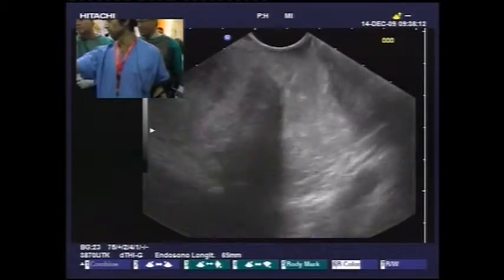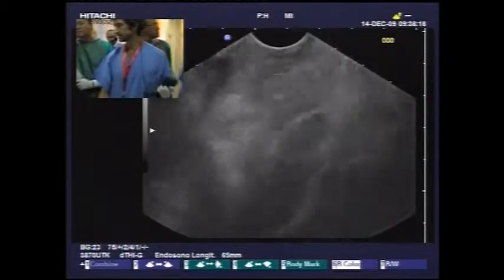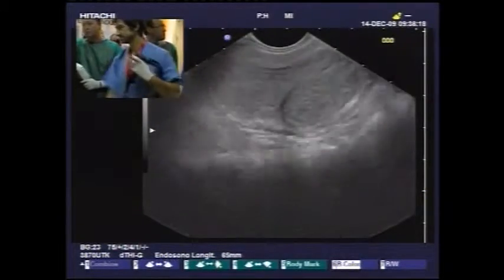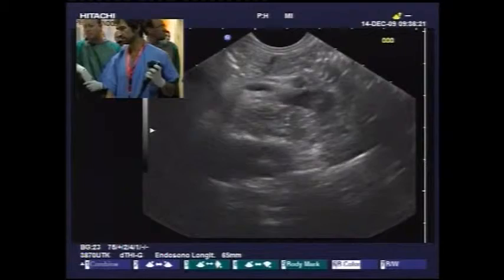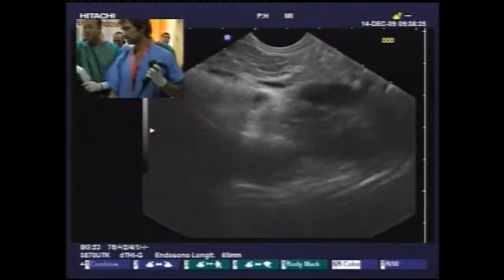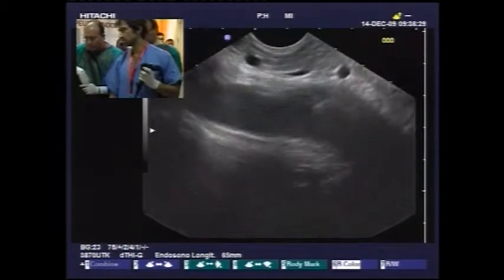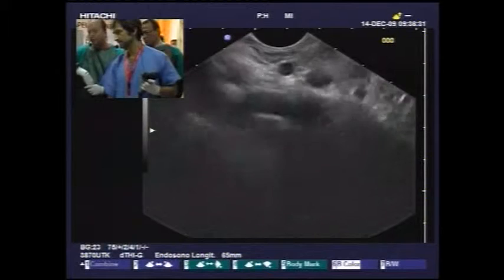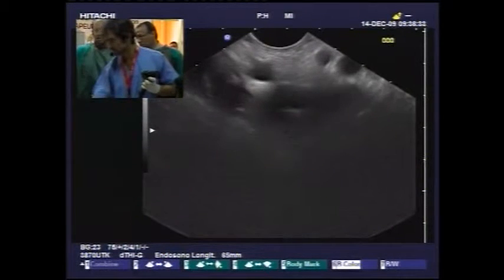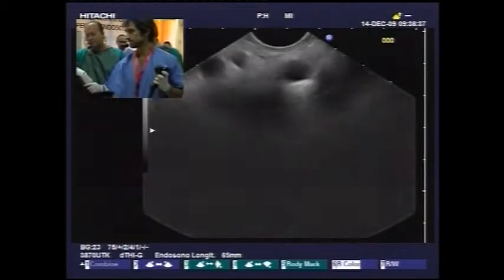We are doing a directed sphincterotomy, and I'm using an endocut here with an autotome so that I can direct it in a specific direction. I'm sucking out all the fluid that's coming out. It's very mucky fluid. In fact, our view is getting completely obscured because of this fluid. I think we'll achieve a lot of drainage. Yeah, already we've achieved a lot of drainage.